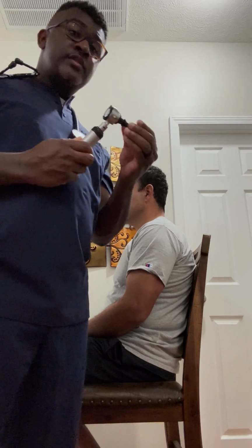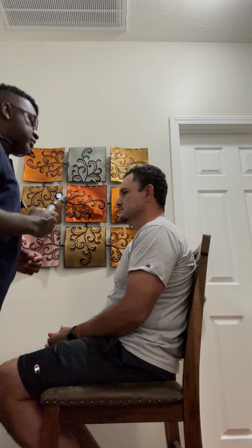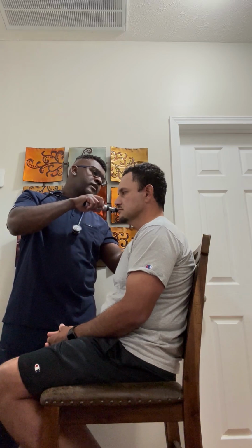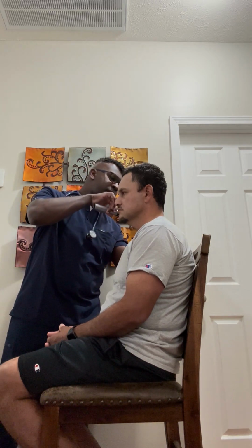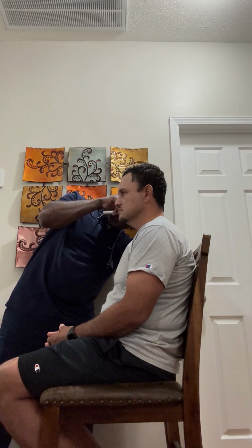And I have the largest tip on here to examine the ears. So what I'm going to do is pull up and then back. Therefore I'm going to examine his right ear, and I'm going to use my right hand. I'm going to provide support with my thumb. I hold it like I'm holding a pen. So as I get closer, examining, going in.